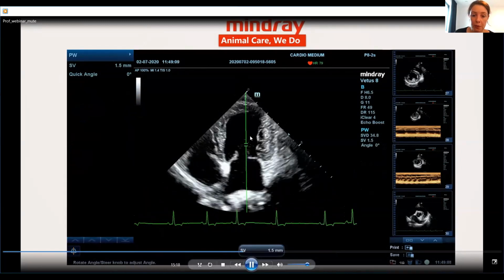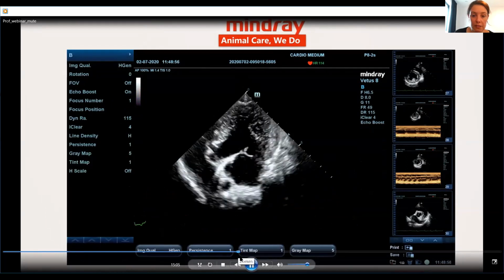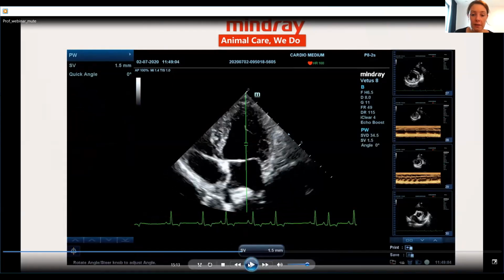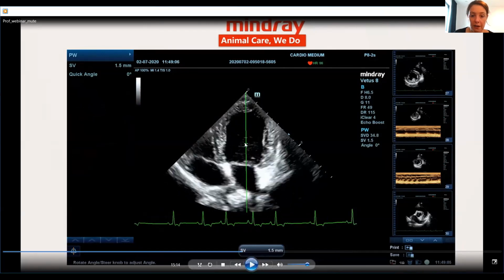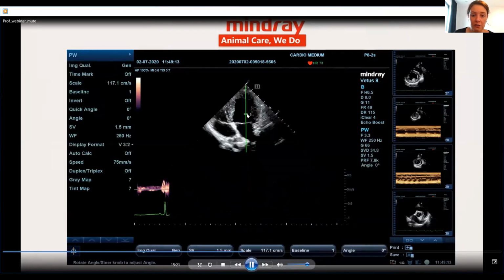This is then the pulsed wave Doppler. You see here the open gates, the sample size that is actually positioned at the tips of the mitral valve. Maybe I'll just go back for a second to show you the position. Yeah, so you see, it's here. It's a bit too high, but the valve is already closing. What you shouldn't do is put it here. You should actually put it at the level of the tips of the mitral valve when they are open, so around here. So not under the mitral valve, not too high in the ventricle at this point.